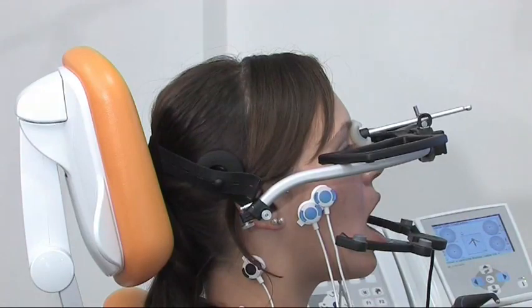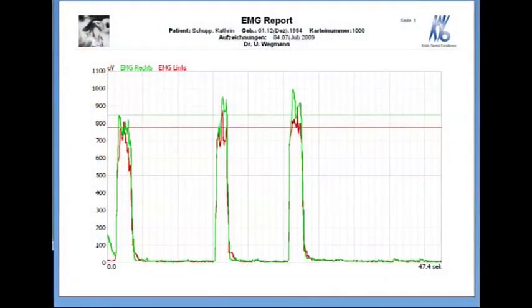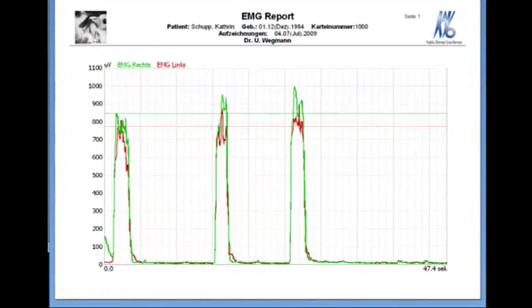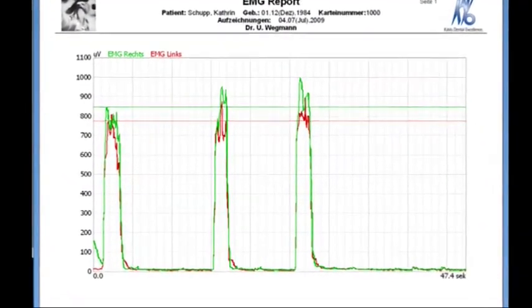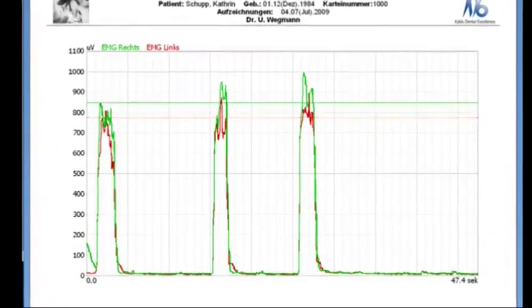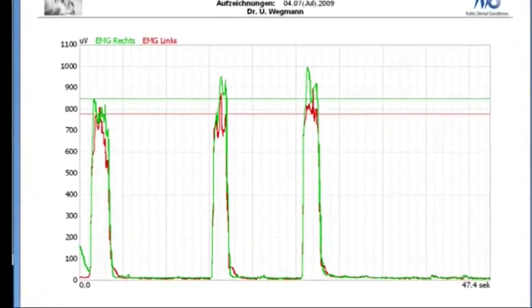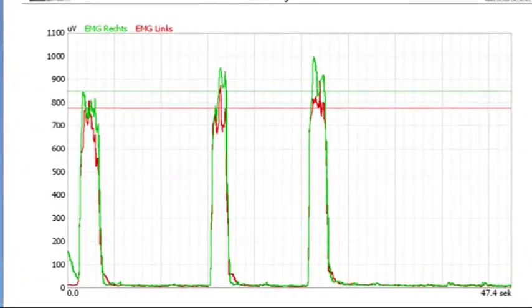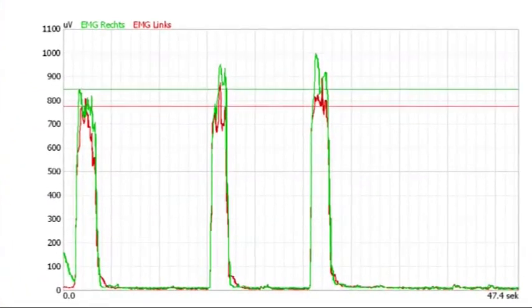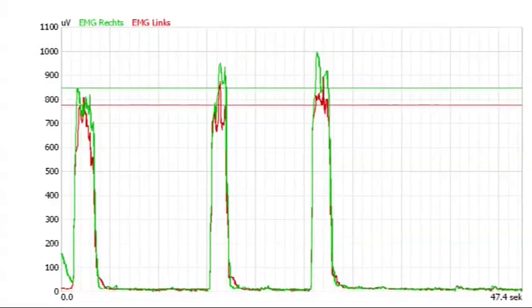As a rule, a high action potential or extremely variable values on both sides are the indicators for an unstable condition of the lower jaw. The display of the action potential of the muscular system during the determination of the centric lower jaw position results in a maximum of information available.